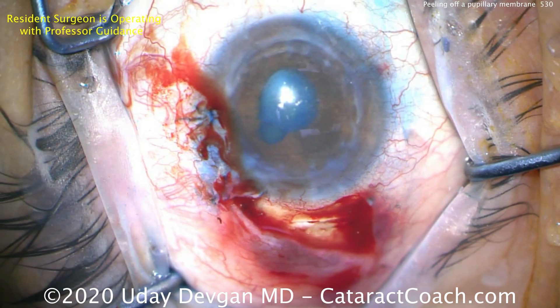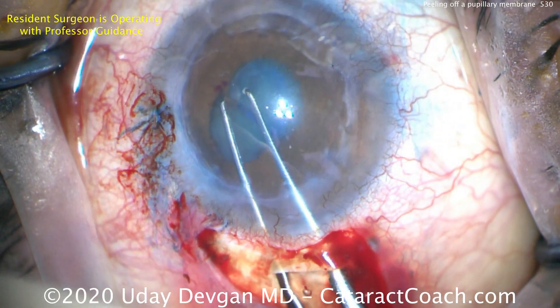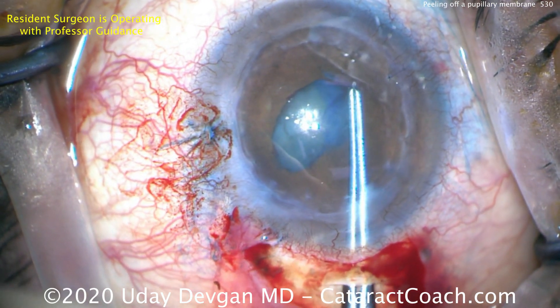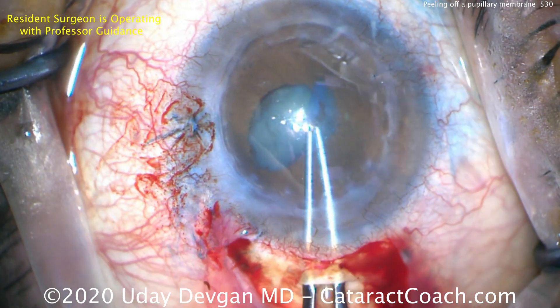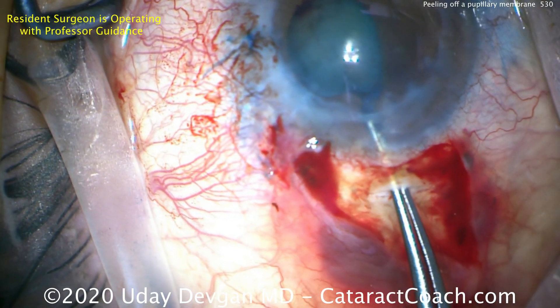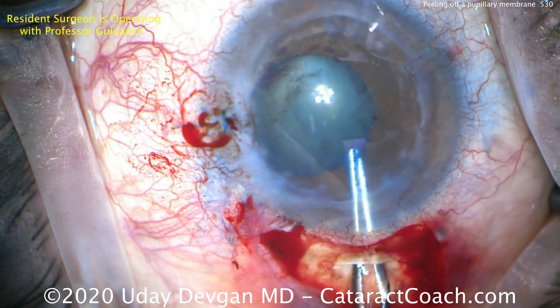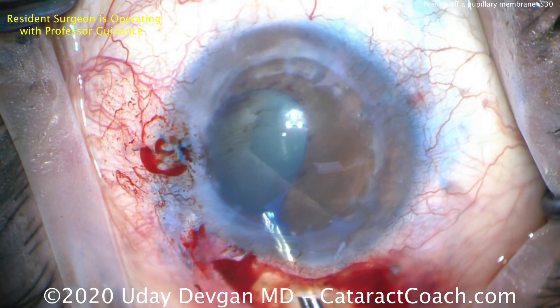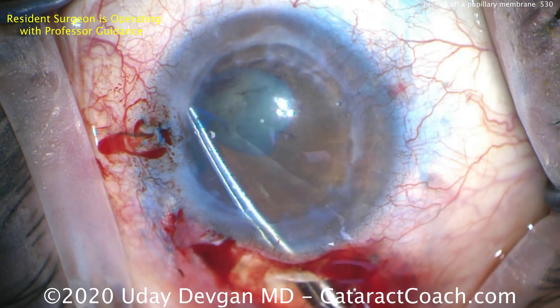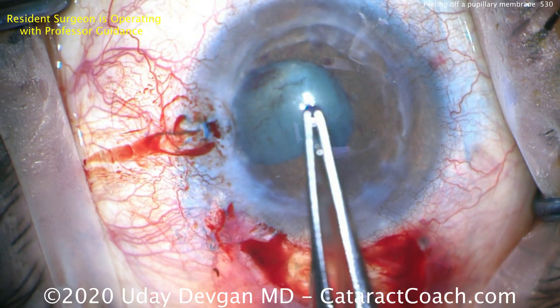The graft is holding up okay — not the prettiest corneal transplant, it was done elsewhere many years ago. Using the capsulorhexis forceps, we're going to grab that membrane and, in almost the same motion as a capsulorhexis, peel off this membrane, taking our time to go around the full 360 degrees. That also helps expand the pupil — even now, just by removing the membrane, you can see how much bigger the pupil has become.